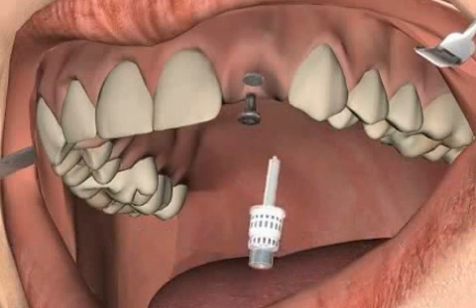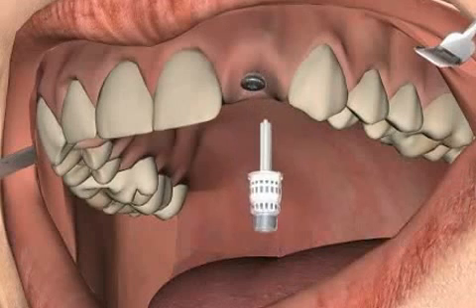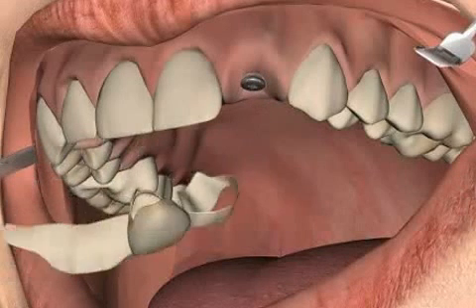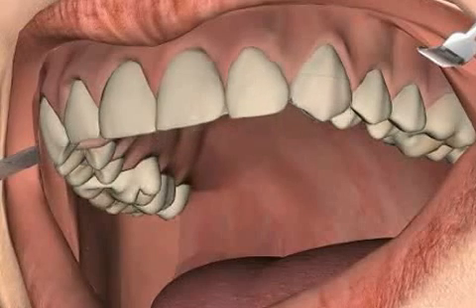Then the gum former, or gingiva former, is inserted. You can find out more in the video by the same name. The provisional solution is reinserted into the patient's mouth until the final treatment is carried out.